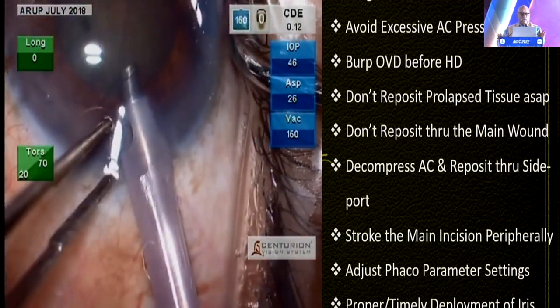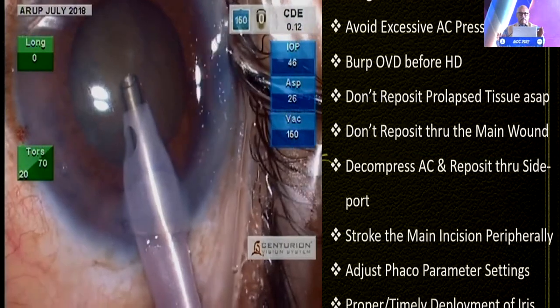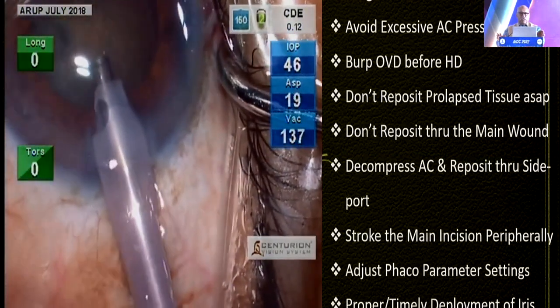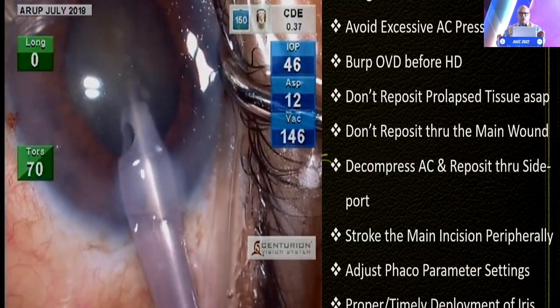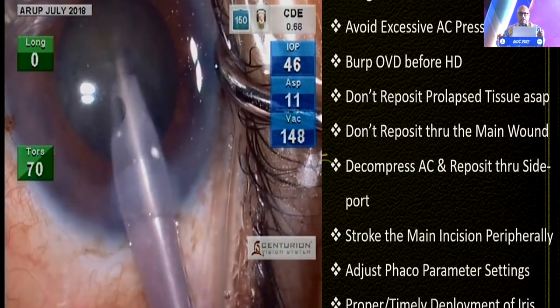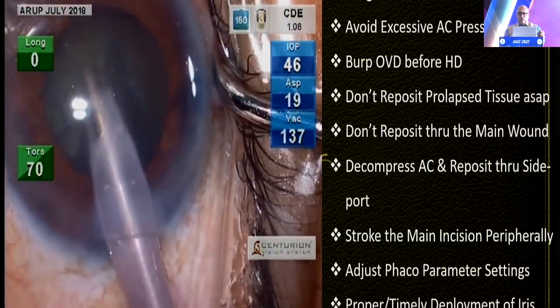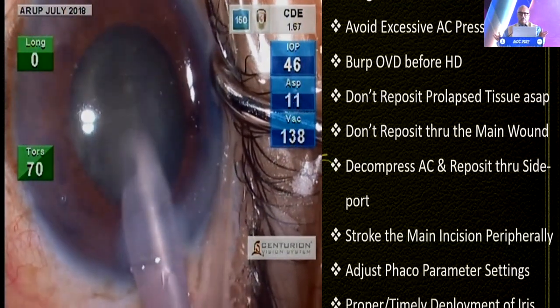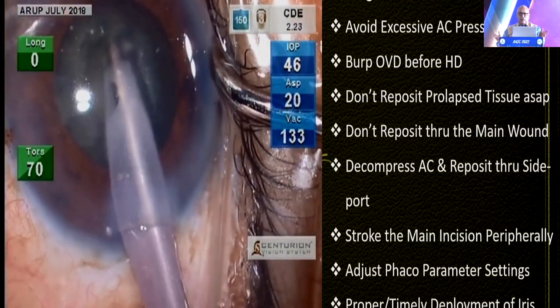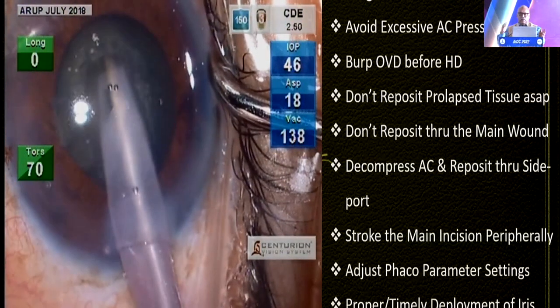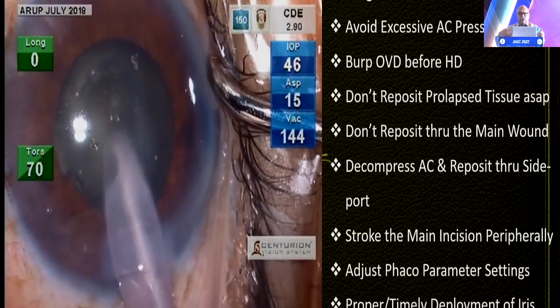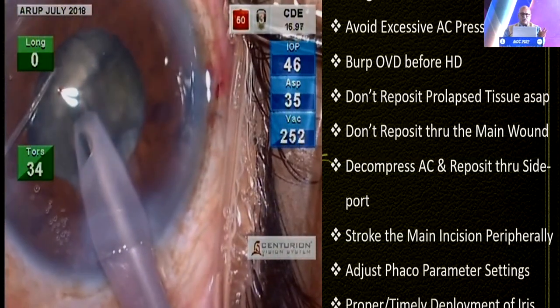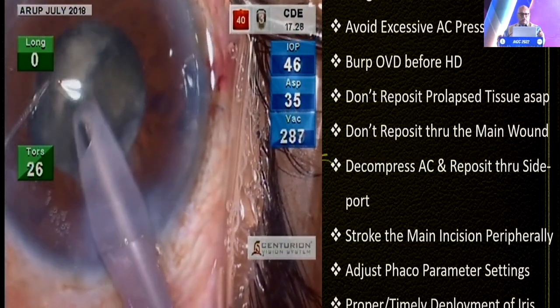I always fixate the main incision with my tooth forceps. Otherwise, if I just support the globe through the paracentesis incision and try to force my way into the eye, there is forcible separation of the incision lips — anterior and posterior — and there is a possibility of iris prolapse. So that can be avoided by this manoeuvre. I then made a deep sculpt and went for chopping.